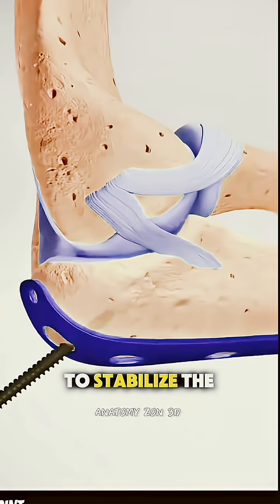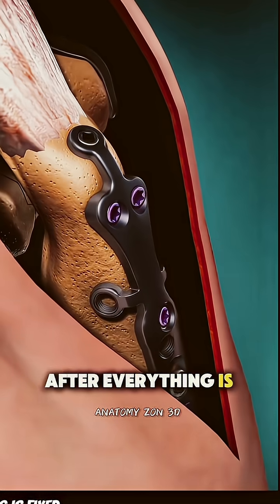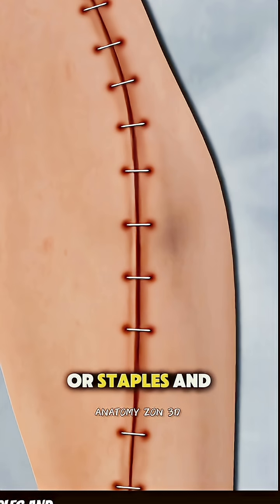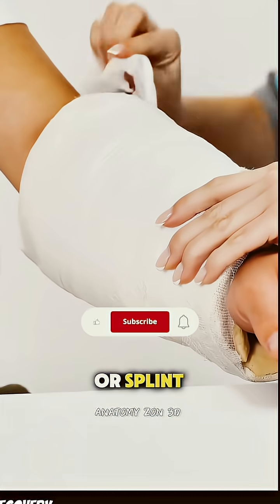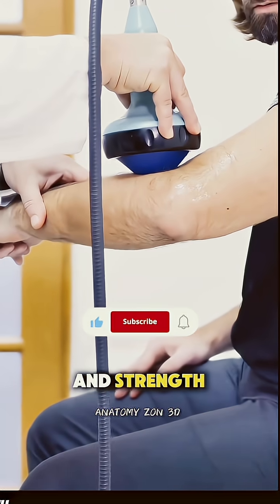The goal is to stabilize the joint so it can heal in the right position. After everything is fixed in place, the surgeon closes the incision with stitches or staples and applies a bandage or splint. Recovery usually includes physical therapy to restore movement and strength.